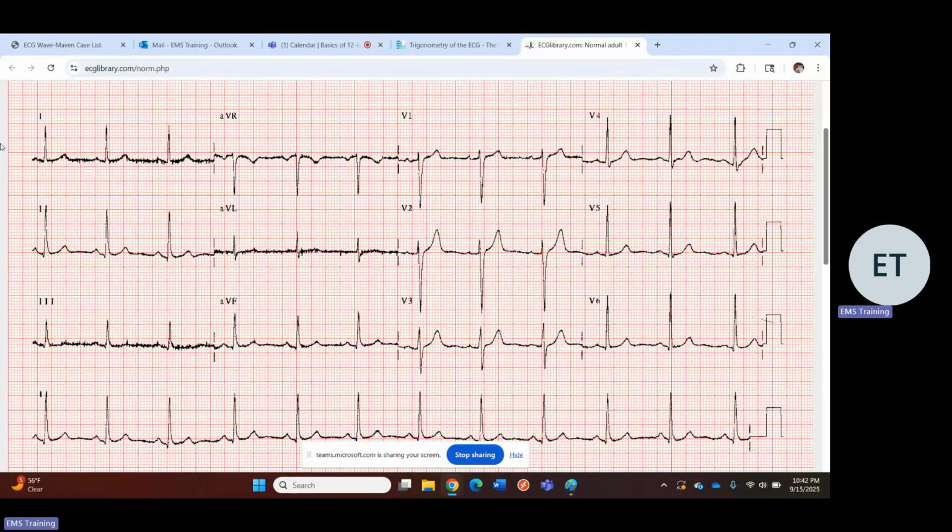Now let's look at the axis on this side. So let's look at lead 1 and AVF, which are the upper and lower limits of this side part of the EKG. There's no lead higher than lead 1. And there's no lead lower than AVF. High lateral, low inferior. This is the upper and lower limit of the heart. So nothing extends beyond this, and nothing extends beyond this. So I like to look at 1 and AVF as my rule maker.